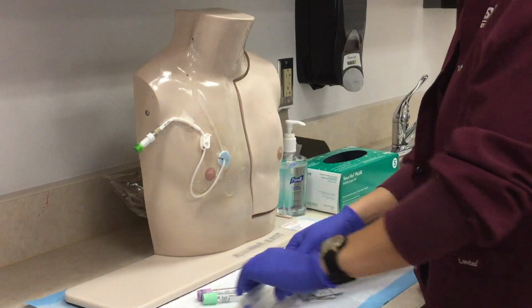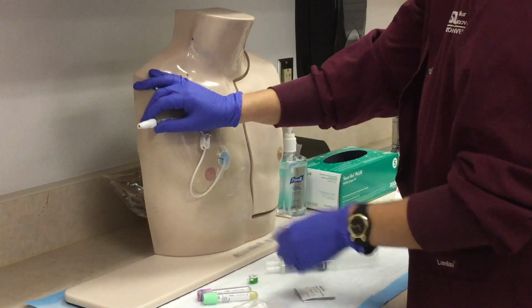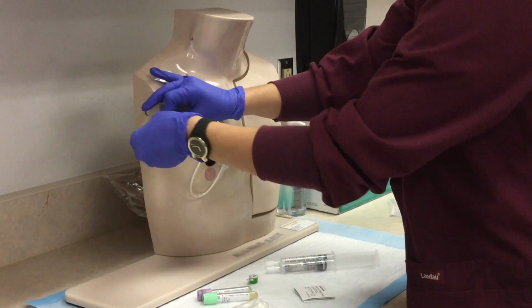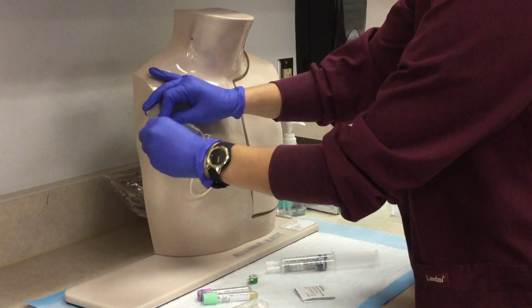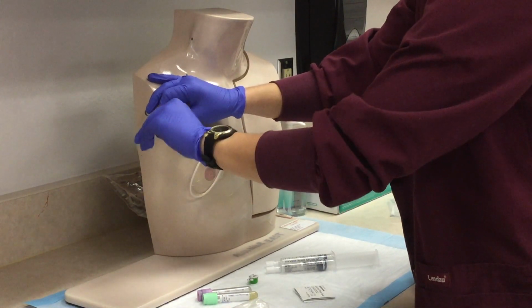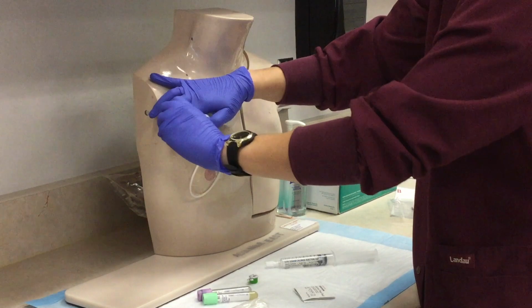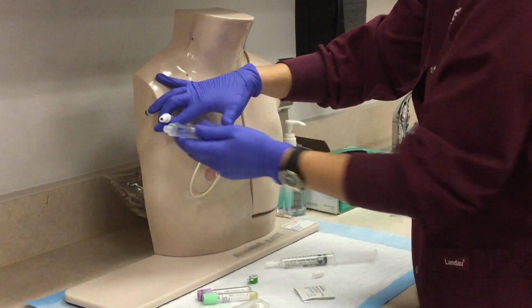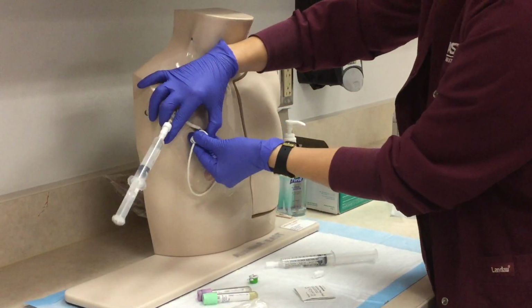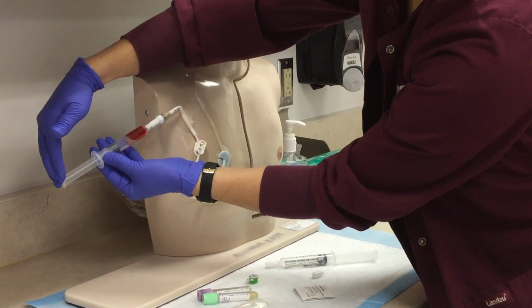Clean the hub with the alcohol wipe for 30 seconds, allowing it to air dry completely. Attach a 10 milliliter flush. Unclamp the catheter and aspirate for blood return. After blood returns, flush the line with 10 milliliters or whatever is indicated by your patient and hospital policy.